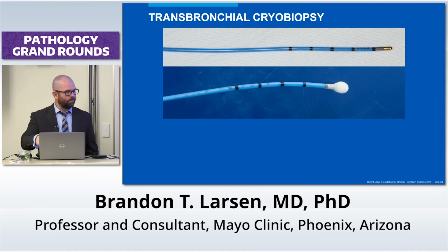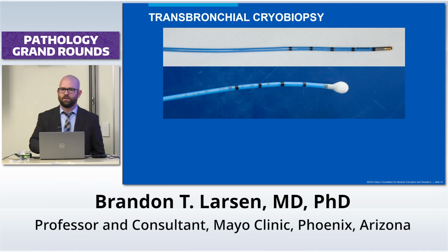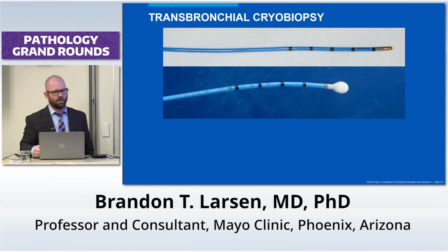And the operator puts it into the appropriate position down in the airway and then turns the cryoprobe on, and it will freeze the tissue into this little snowball with an enlarging piece of frozen tissue. It's like sticking your tongue to a flagpole in the middle of the winter, if anybody saw the Christmas Story movie for the holidays like I did. And the longer you hold your tongue stuck to the flagpole, the more your tongue freezes on the flagpole.